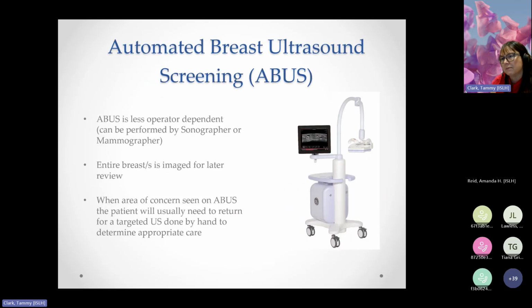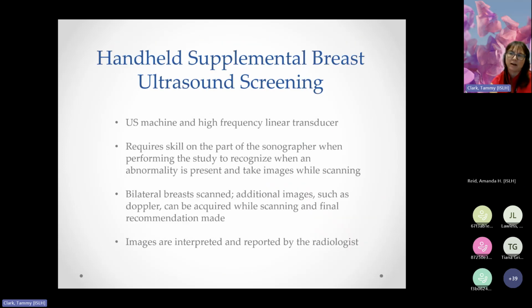Oh, and the one thing I missed that some people might be thinking: how long does it take to do a handheld exam? It takes between 30 to 40 minutes. Here in Victoria, we're giving 40 minutes to do that scan. I would rather have that little bit of extra time.